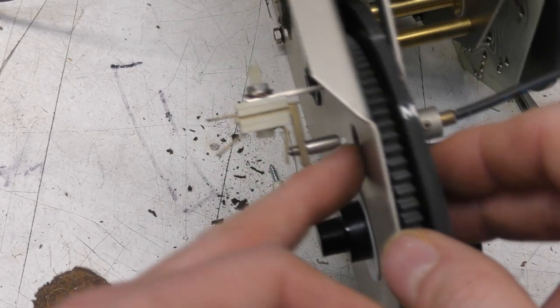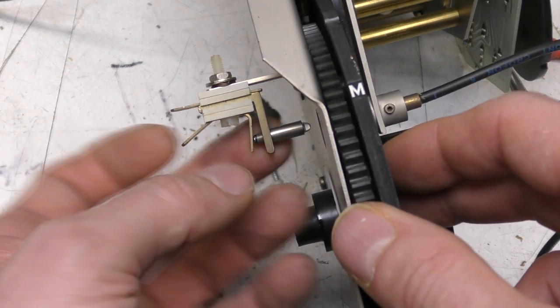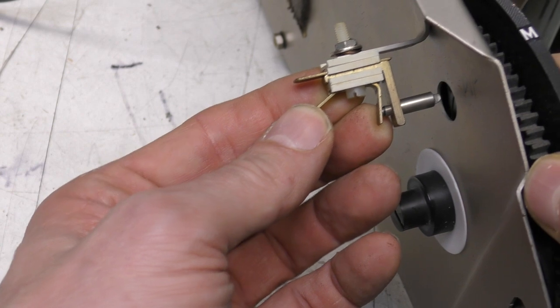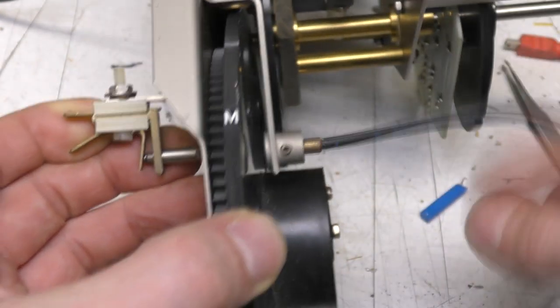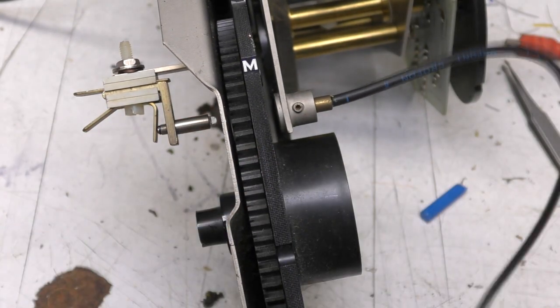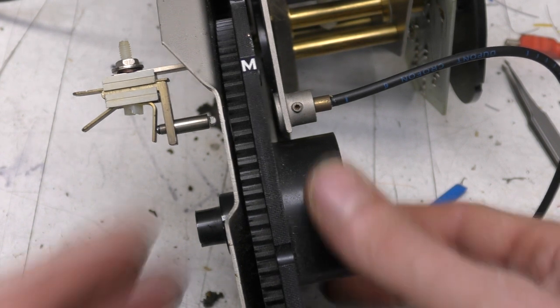This is the fibre optic assembly. We've got this tiny little bulb with a focusing lens built in. That's the one that we saw that spare of at the beginning, with what looks like some sort of improvised holder going through to this fibre optic cable, which then goes on the front panel, which does seem a somewhat overcomplicated way of doing that.